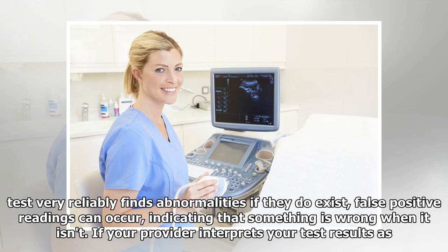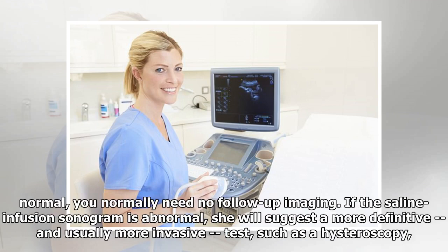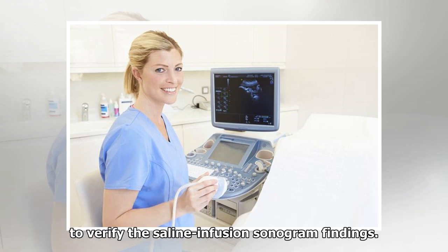If your provider interprets your test results as normal, you normally need no follow-up imaging. If the saline infusion sonogram is abnormal, she will suggest a more definitive, and usually more invasive, test, such as a hysteroscopy, to verify the saline infusion sonogram findings.